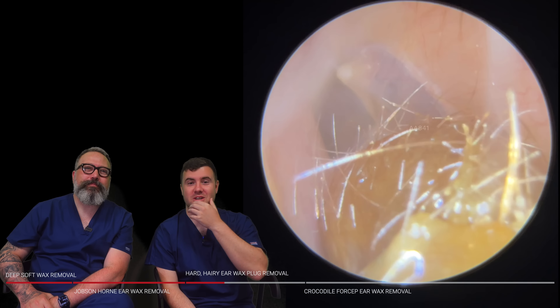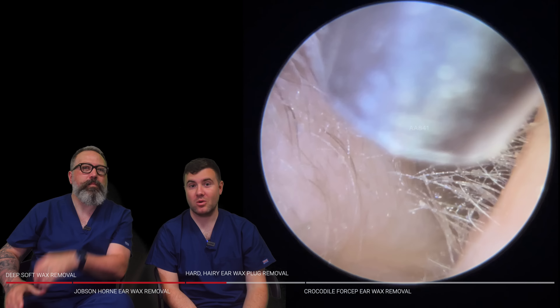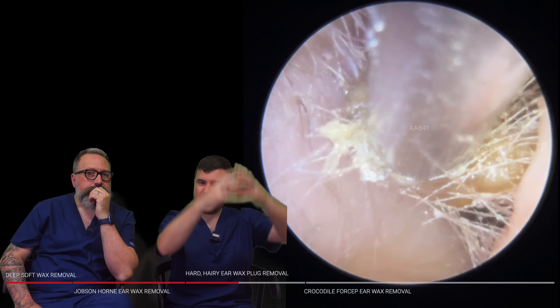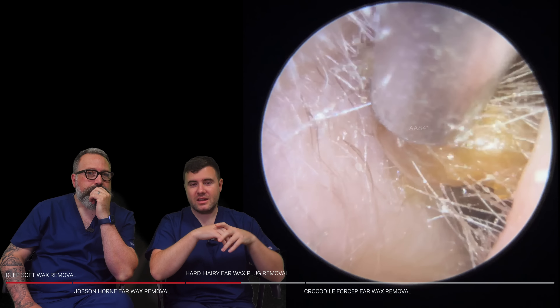It's been a while. So this is my patient — I think there's four patients in here altogether. Just very soft, very deep wax — not nice ones to remove, these ones. Not easy. Very rarely they come away clean either; they usually leave a little bit of debris behind. And they normally never come away in one go. Always bits break under this.